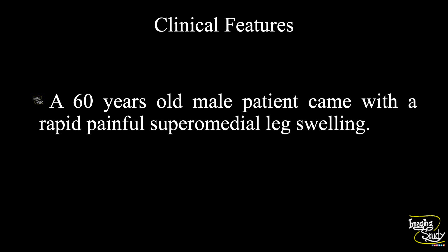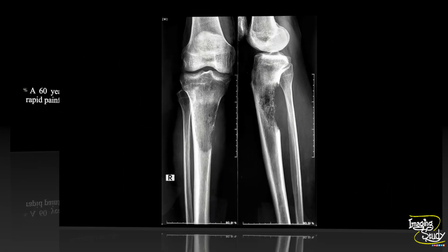Let's see what we have on X-ray. These are the AP and lateral views of the X-ray of the upper leg, and you can see there is a lytic lesion involving the upper part of the tibia. We found an ultrasound report of this patient from around two months back, when there was no feature of bony destruction on ultrasound.